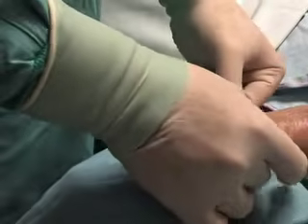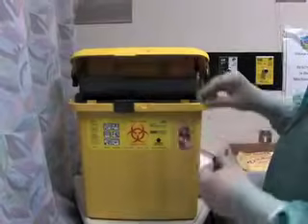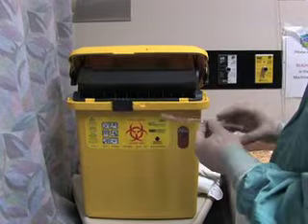After pressure has been applied to the puncture site for 5 minutes, affix the gauze with some tape. Dispose of all sharps in the designated sharps containers.